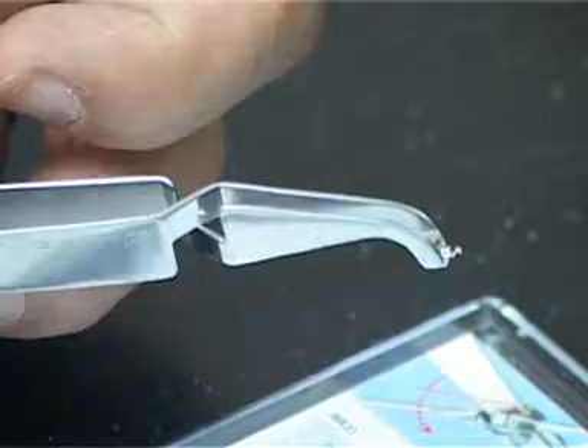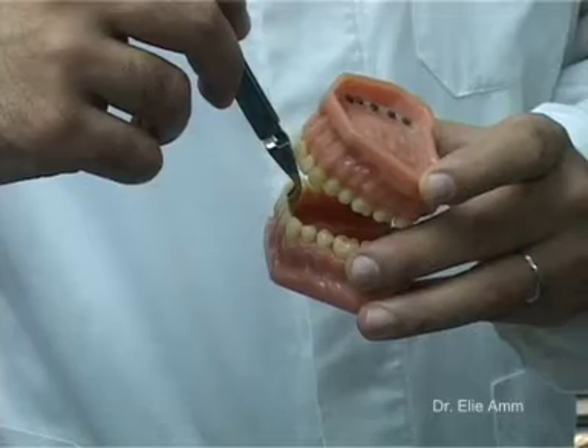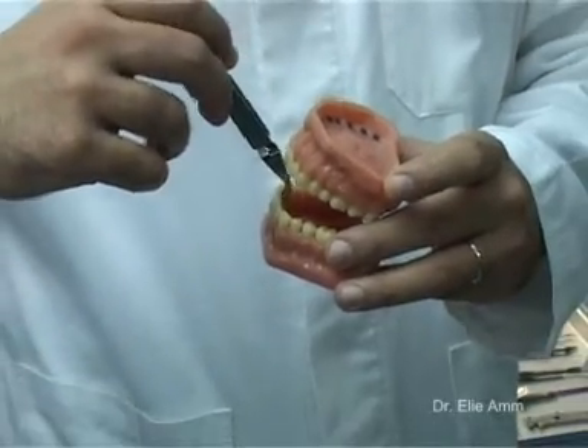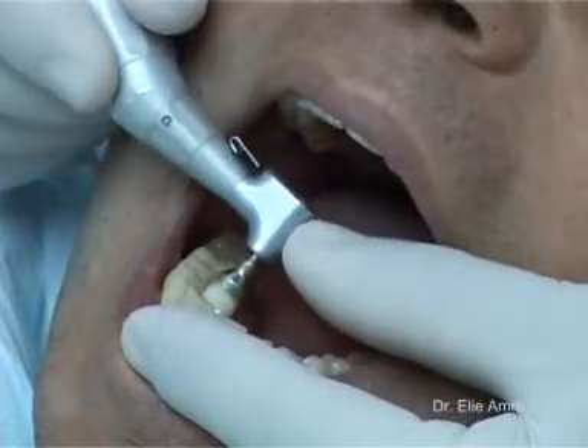It is recommended to hold the bracket in the same tweezer that you use in labial bonding, but in this specific way to make it easier to introduce it into the mouth of the patient with minimum interferences with the upper jaw. We start first by cleaning and pumicing the lingual side of the teeth to be bonded.